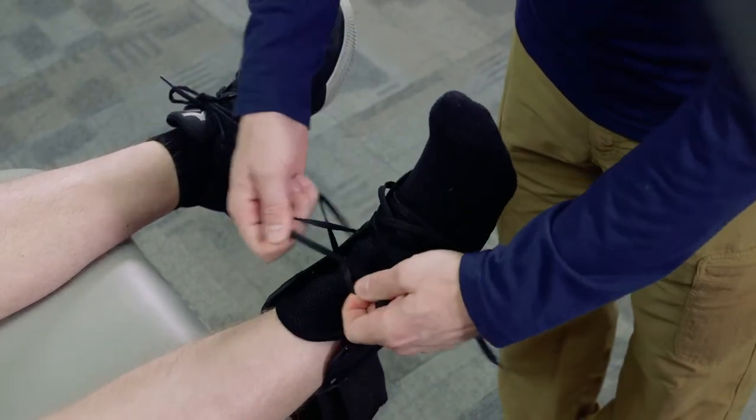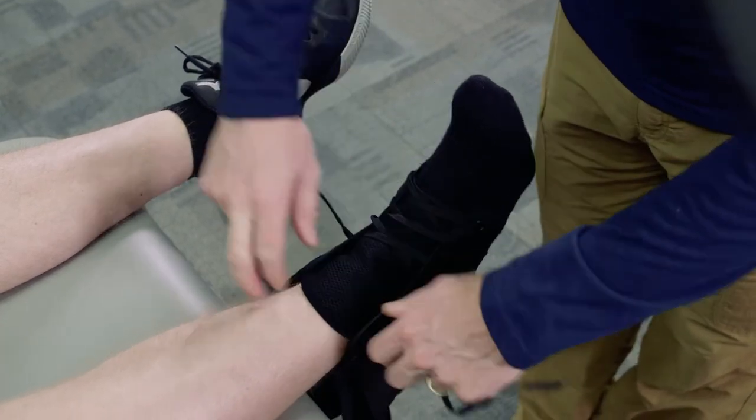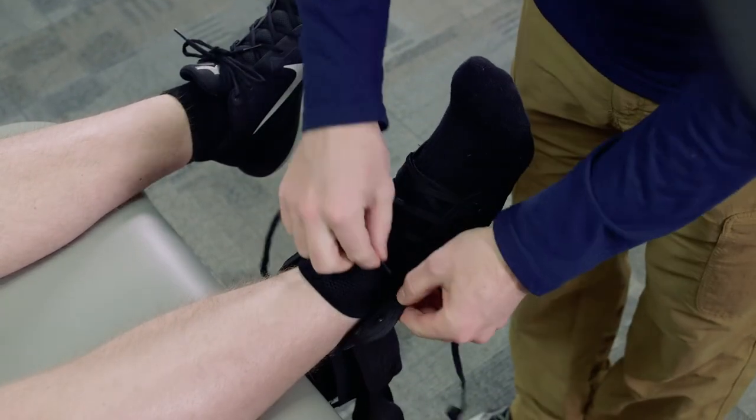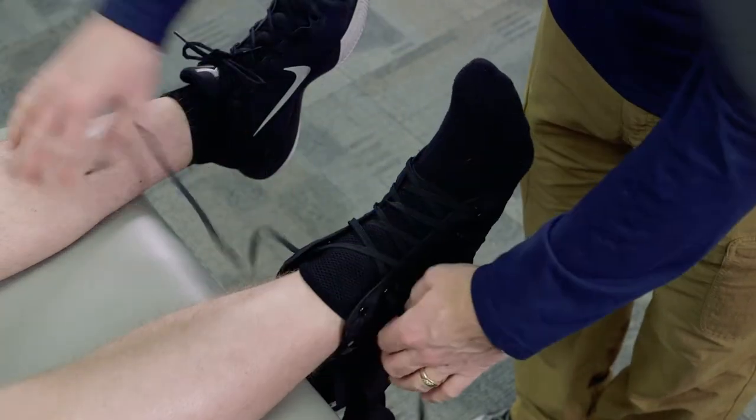We want to secure it and tighten it down with the laces. We don't want it too terribly tight because we don't want to cut off any circulation, but we want to make sure that it's nice and secure.